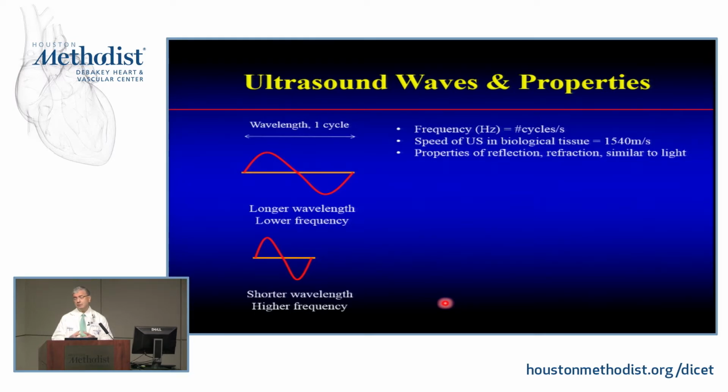And you also need to know that you can have frequencies in the 30 megahertz, even 50 megahertz range. So a very, very small wavelength, which improves your resolution almost like an ultrasound microscope. But these are very thin, basically a microscope using ultrasound as opposed to just imaging, okay?